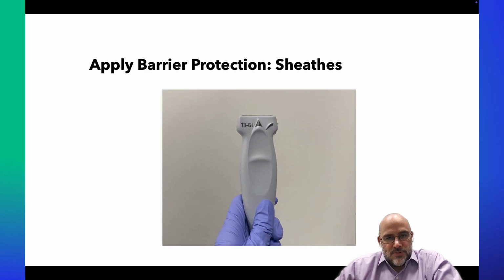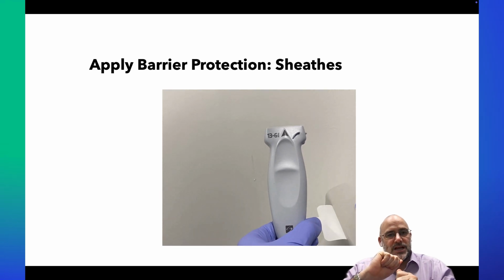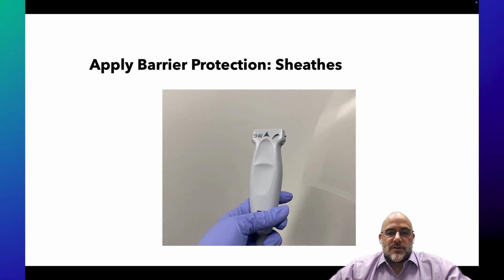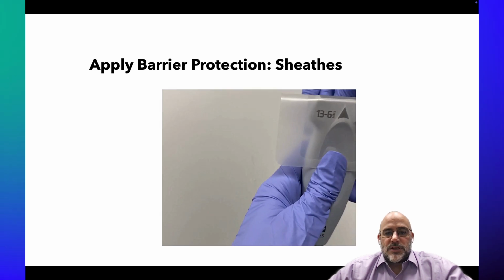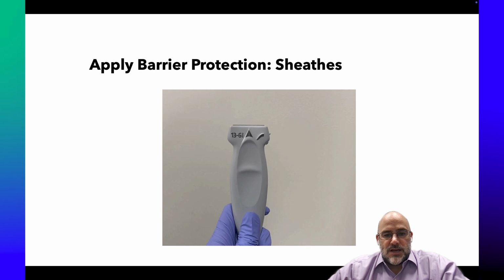And this is how we would apply that, kind of like a Steri-Strip, where I make sure that one side is nicely adhered, and then you pull across. We'll see what that looks like here. I want to make sure that that doesn't touch anything off screen there. We'll make sure that we've got a nice adhesion there. We'll pull it taut, not so taut that it wrinkles, but taut on that other side, and now we're ready to go.